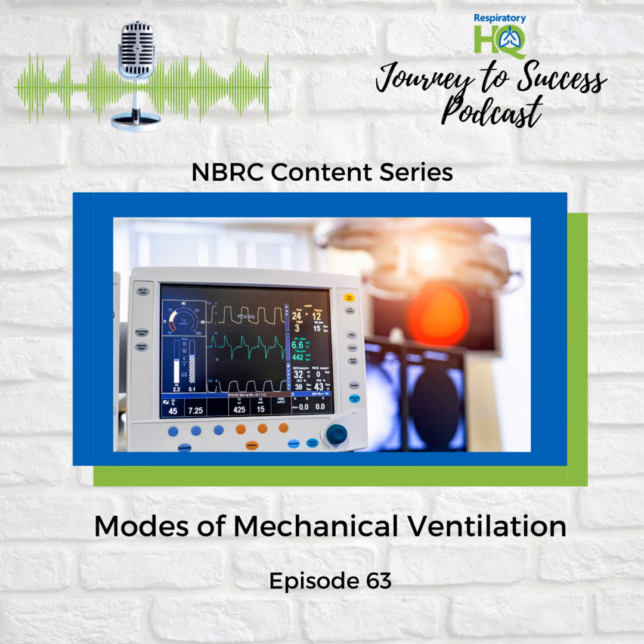So it's like the two breaths are colliding. Yes. And that can lead to higher pressures in the lungs, potentially causing damage to the lung tissue. It's definitely something we want to avoid. I can see why. So how do clinicians navigate that potential problem? Is there a way to avoid breath stacking?